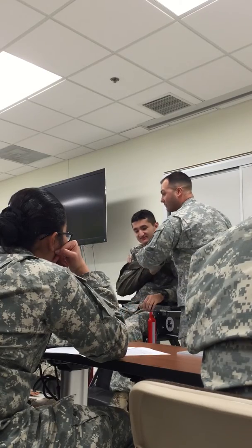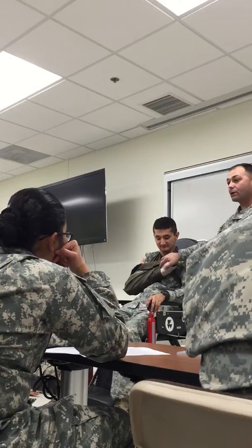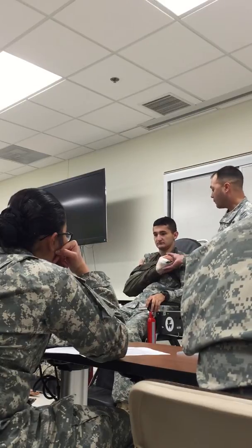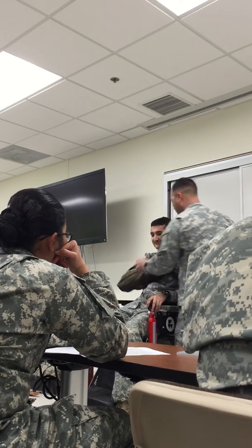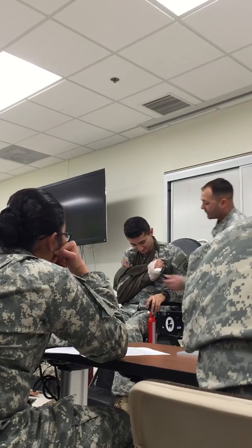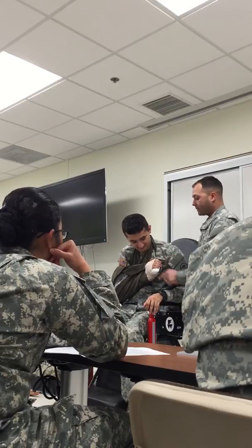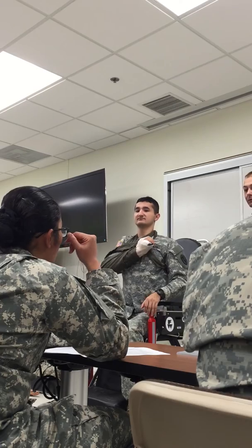How are you doing? I still have a pulse. Notice that it didn't go over his hand. It went over the arm, over the sling, and to immobilize the arm. Now, what you don't want is the chicken wing going on. So if it is flopping around, you may need to tie a little bit tighter. How does that feel? Good? I'm looking for capillary refill. I'm assessing for pulse. There is a pulse. Did not cause further injury to the patient.